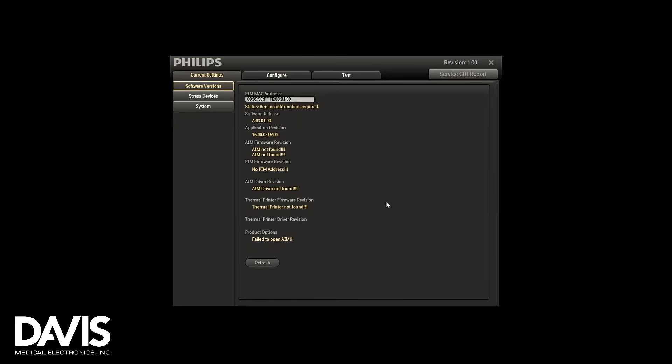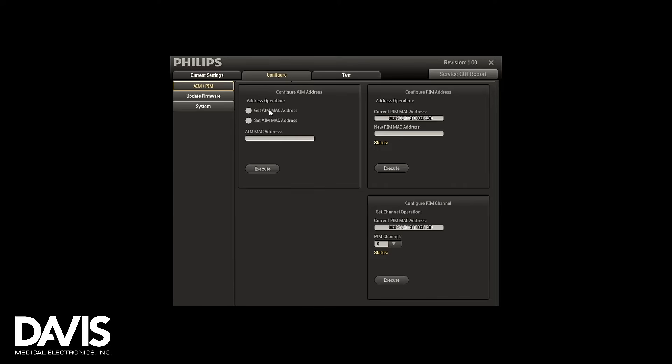The service menu will automatically pop up. Click the configure tab, check off get Mac address, and execute. You should get a Mac address acquired. Next, select set Mac address and you should get a message that says Mac is modified.